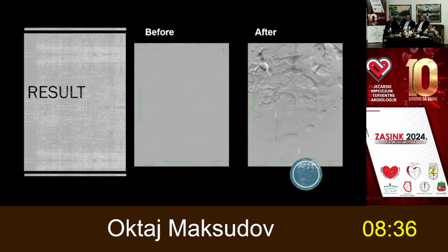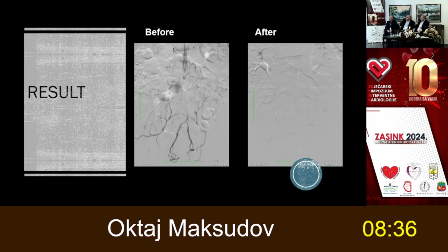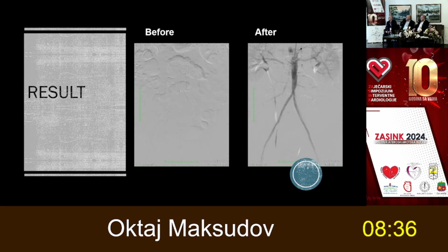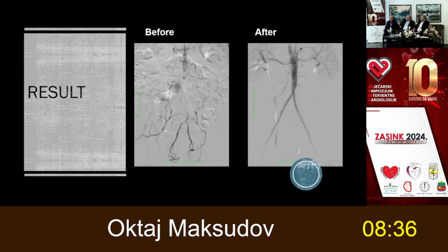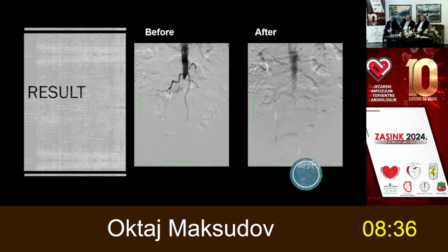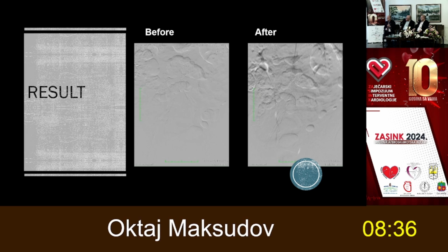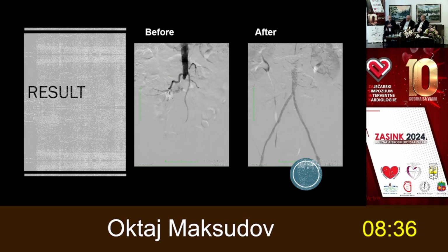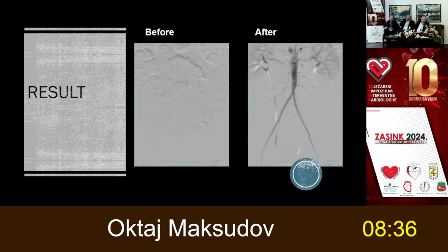And I don't want to go into this situation with this patient. So this is why I have to resolve this in the most secure way. Maybe we will place a further device on the left femoral.